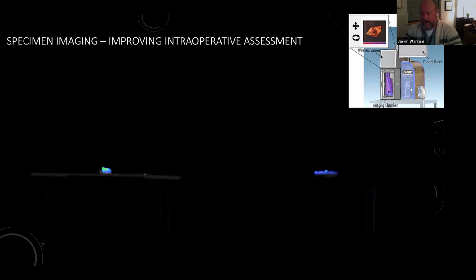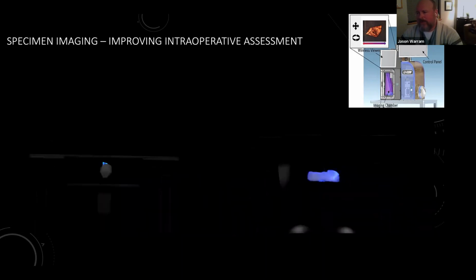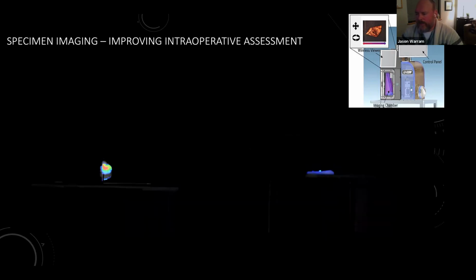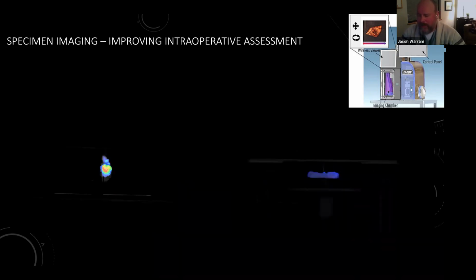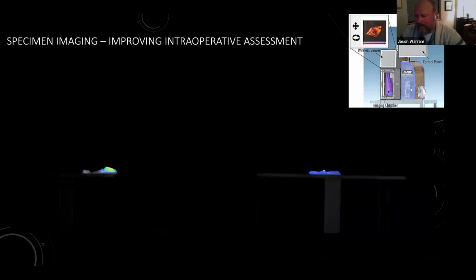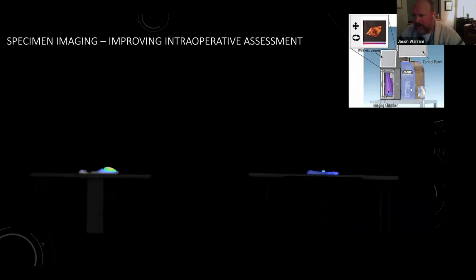For our studies, we have a pathology component written into our protocols so that we can do this extra imaging in pathology, in a histology setting, so that we can show where the tumor tissue is relative to normal. The other thing we've been doing recently, in order to capture the patient benefit: if you approach the FDA with the use of this technology in pathology, they're going to define the metrics they're looking for. If it follows the surgery portion, then in pathology it would be, did the fluorescence allow identification of missed cancer that would otherwise not have been seen?